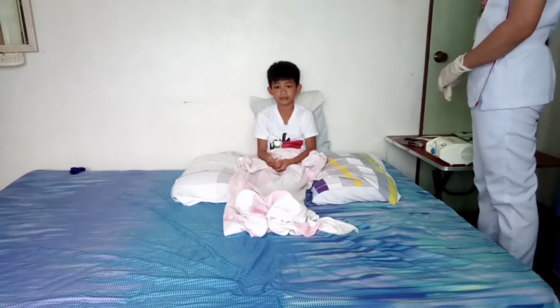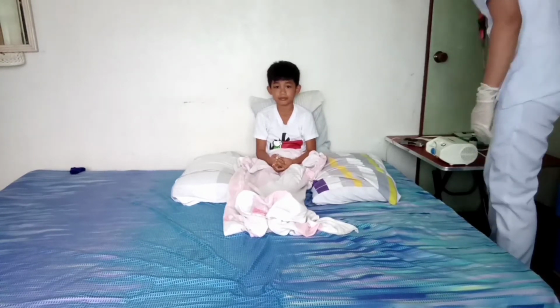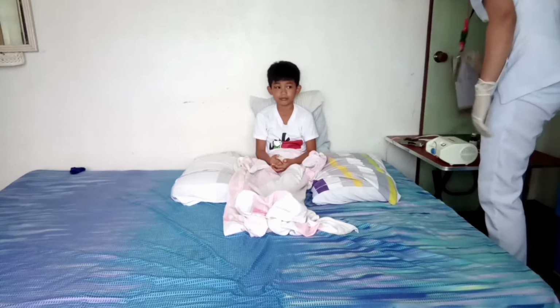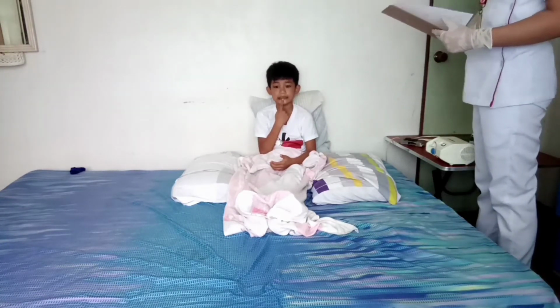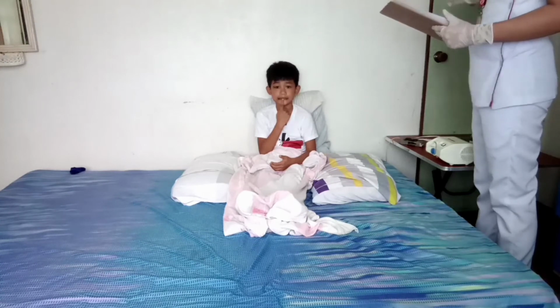And then observe the patient for any adverse reaction from the treatment. The patient may develop bronchospasms due to inhalation of aerosol, and it may cause dry and retained secretions in the airways.